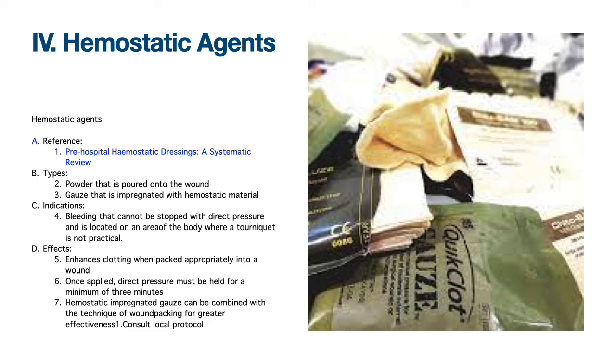Once applied, direct pressure must be held for a minimum of 3 minutes. Hemostatic impregnated gauze can be combined with the technique of wound packing for greater effectiveness. Consult with your local protocol.